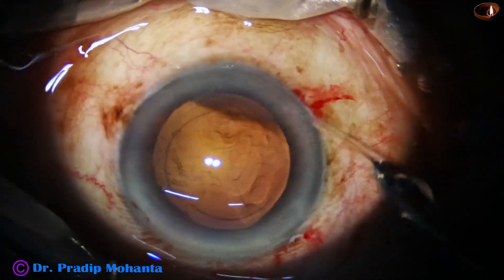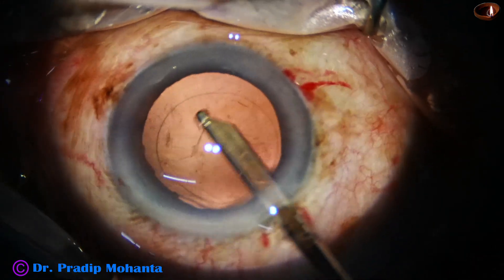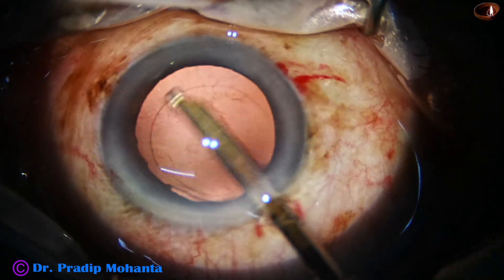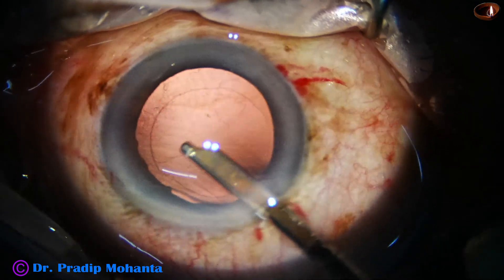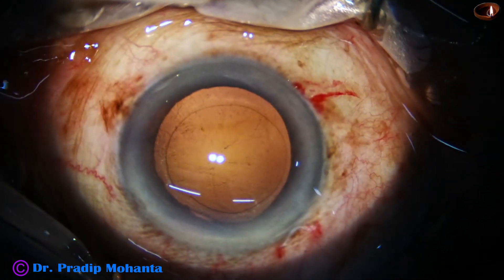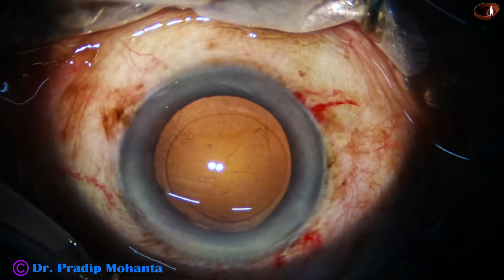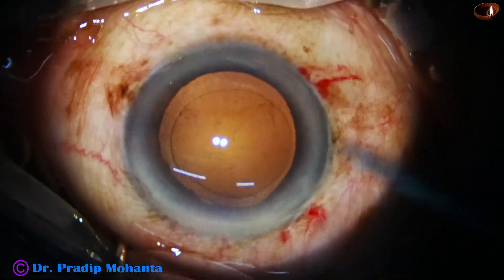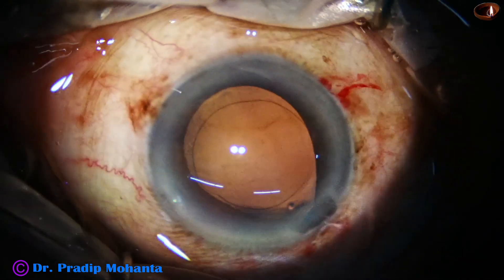Now I am using this 23 gauge SIMCO cannula to remove some of the fibers that are sticking to the posterior capsule, and one end of the fiber is lifted off. So you can hold it with the SIMCO and remove it. Then I take the irrigation cannula and do some more polishing with the irrigating jet of fluid.